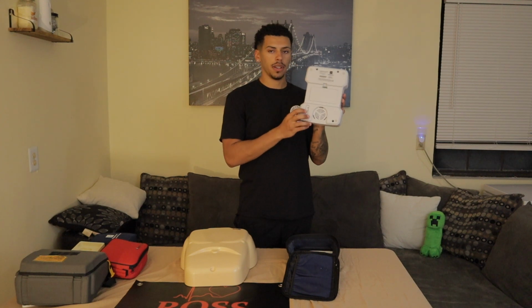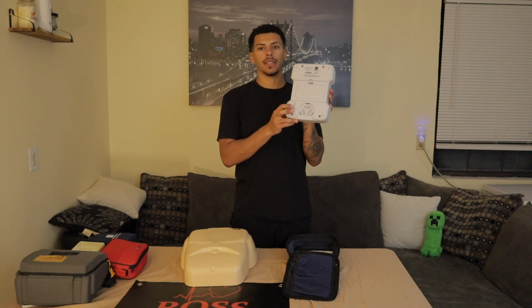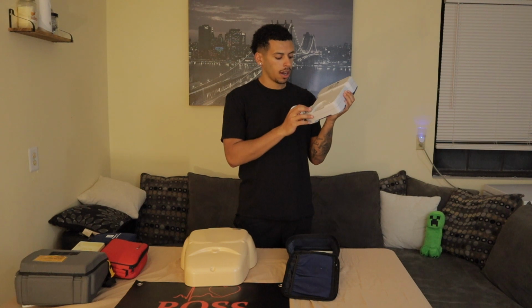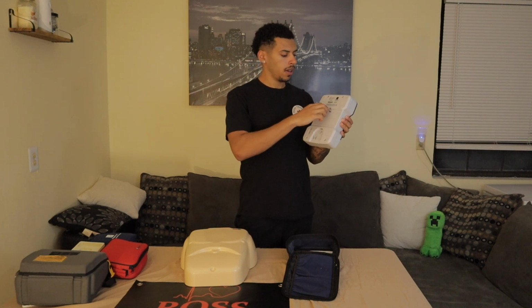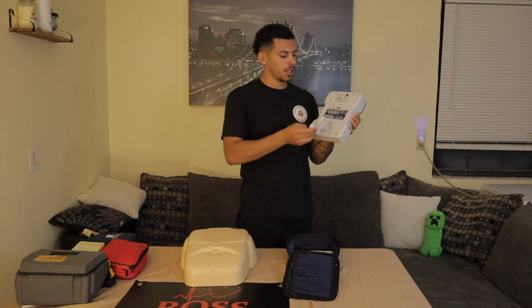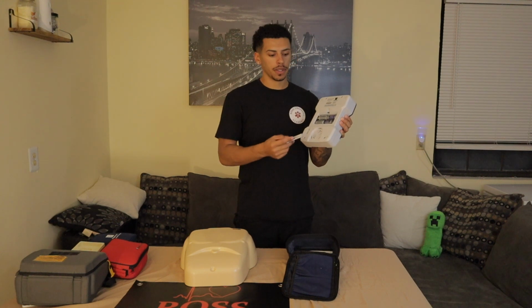So we're going to go ahead and start over on the back side. We have a little device in here. This is going to be for your language. This one here is going to be English and Spanish. But you can get other chips with different languages. And then the battery compartment, it's just going to take 4 C batteries.